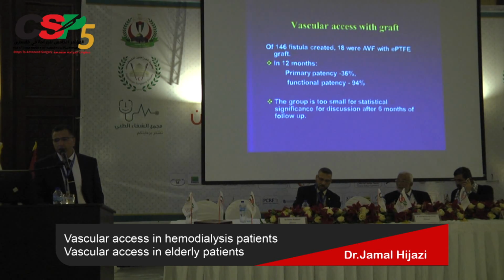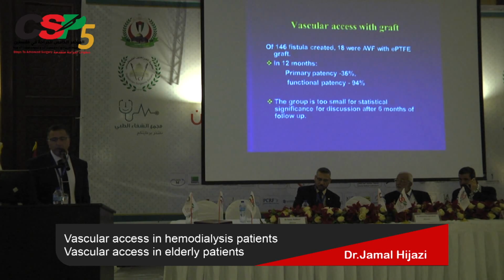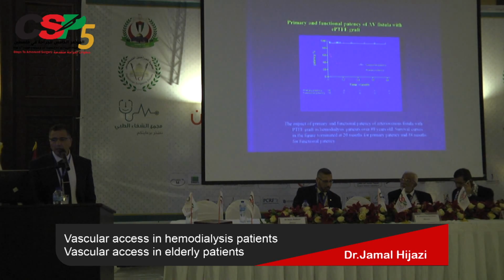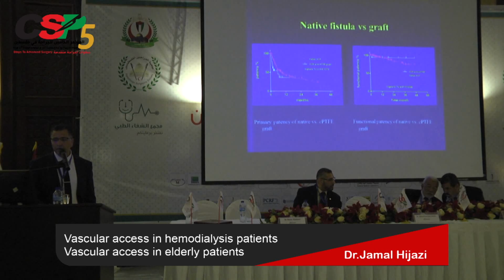For the 18 grafts with PTFE, the primary patency at 12 months was 36% and functional patency 94%. This group is too small for statistical significance after 6 months of follow-up. Here's the graph that shows the primary and secondary patency of this type of fistula.